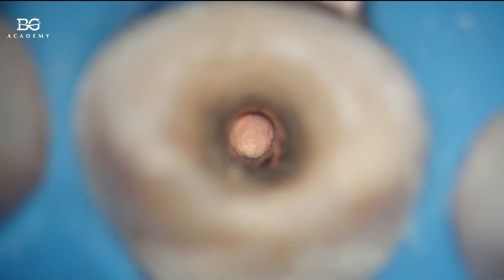The first portion of the MTA we usually place without any mixing. After that, we mix MTA according to the instructions and plug it into the root canal as usual, creating around 3–4 millimeters of the apical portion of the MTA. Then we start doing our obturation. Here is the view of the MTA placed that way, and here we have after obturation.